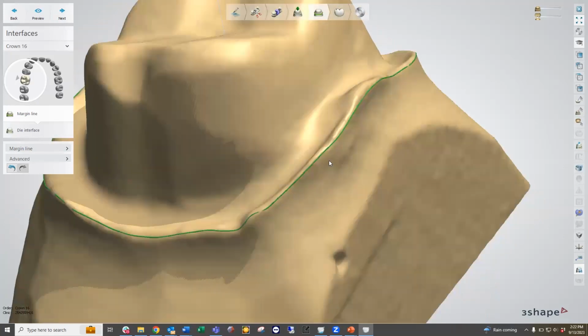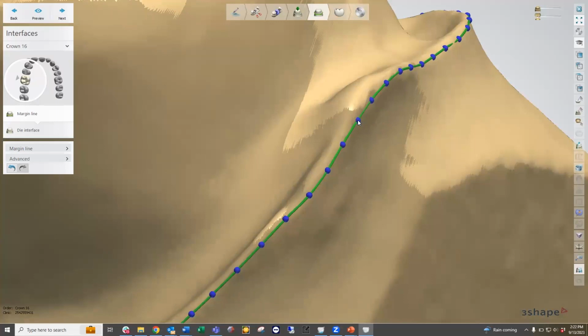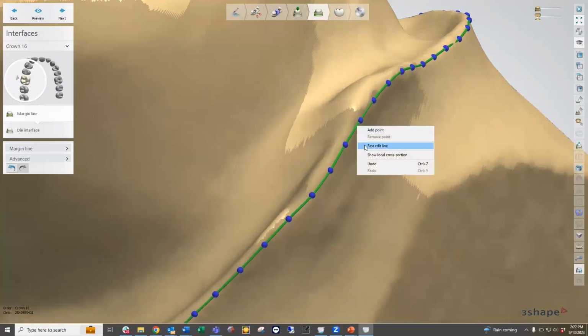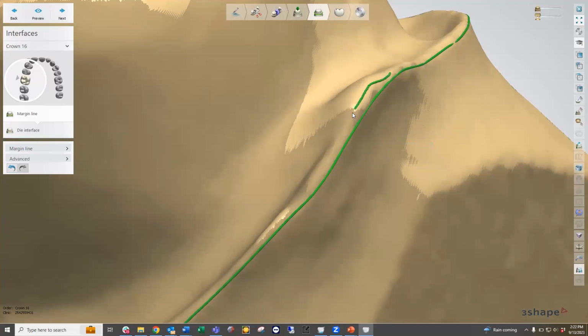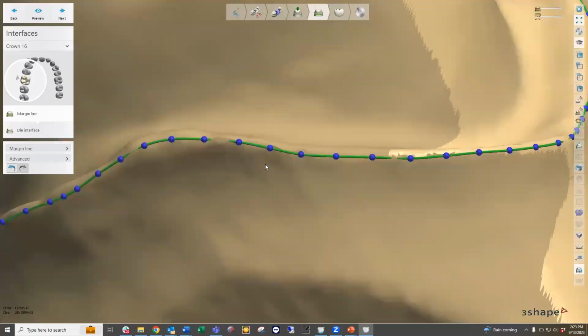Now, if we have to do really fine tuning of the margin, we can right click on the margin and unselect the fast edit spline. So this isn't a spline where we click and drag a line where we want it to be. That's called a spline. But if we uncheck that fast edit spline, it changes it into dots, and we have a little bit more freedom to make finer adjustments to that margin line, without making large adjustments to further areas.